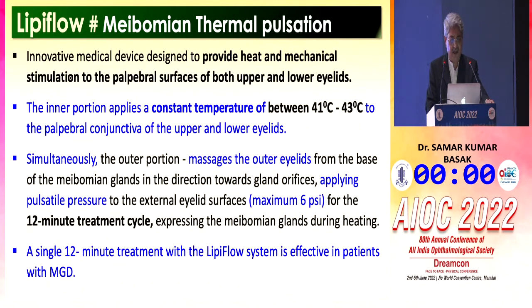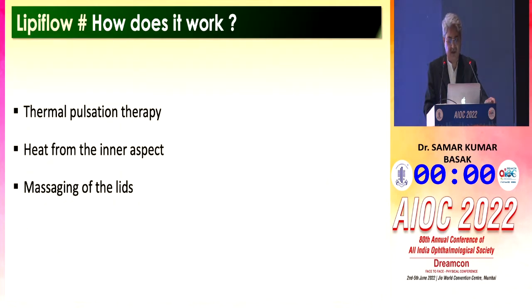So I'll be talking about LipiFlow only. LipiFlow has a typical constant temperature between 41 to 43, and it applies pressure of 6 psi in a 12-minute treatment cycle. The whole procedure requires around 20 minutes, including fitting and all the connections, but the actual treatment is a 12-minute cycle, and it's effective in patients with MGD.